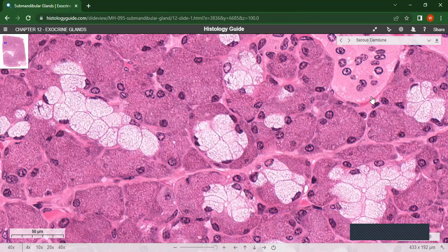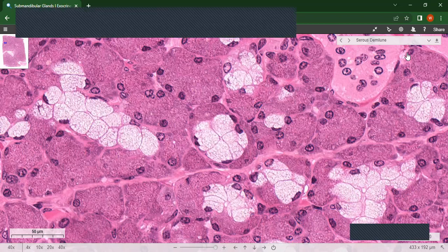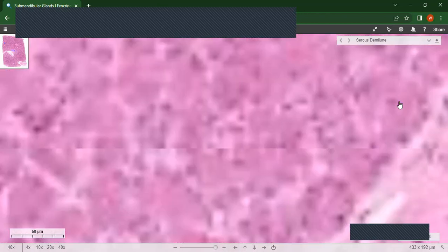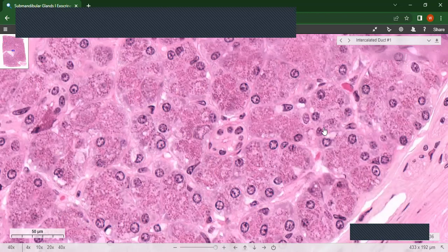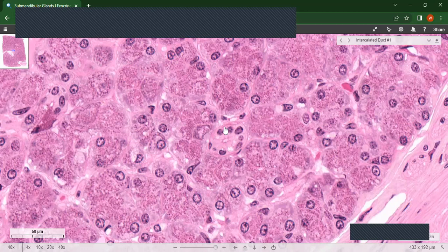The intercalated ducts are more lightly stained than the acini cells and are low cuboidal. Their lining epithelium is simple cuboidal epithelium. Here is an intercalated duct — you can see the epithelium. To identify the epithelium type, look at the shape of the nuclei: if it is round, those are cuboidal cells; if elongated or oval, that is columnar; if flattened, that is squamous. This is a cuboidal cell and it is a single layer, so it is simple cuboidal epithelium.